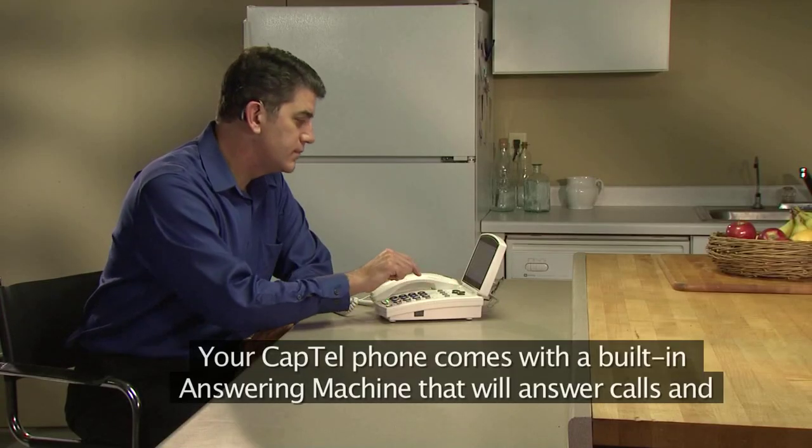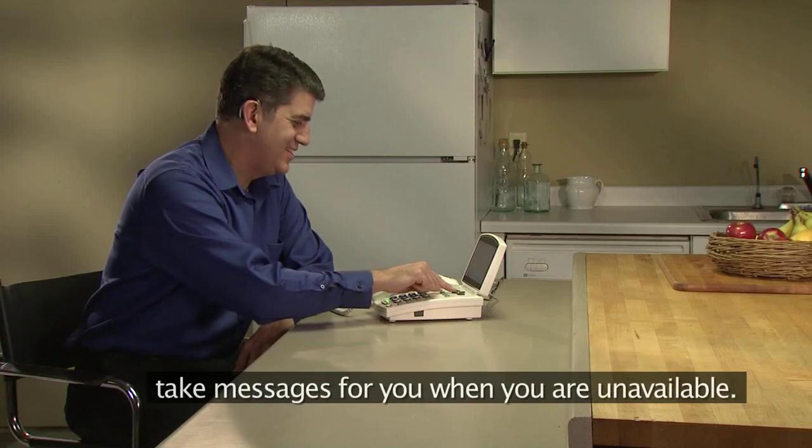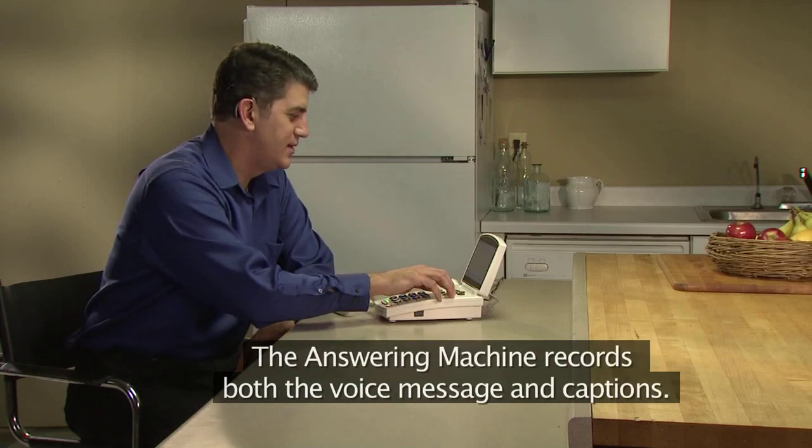Your CapTel phone comes with a built-in answering machine that will answer calls and take messages for you when you're unavailable. The answering machine records both the voice message and captions.